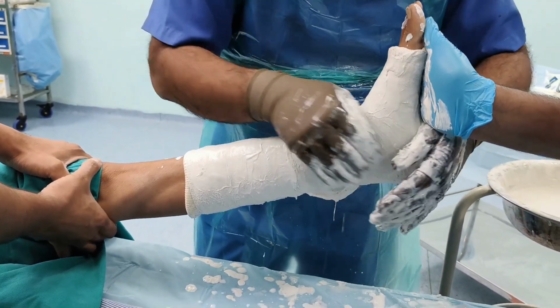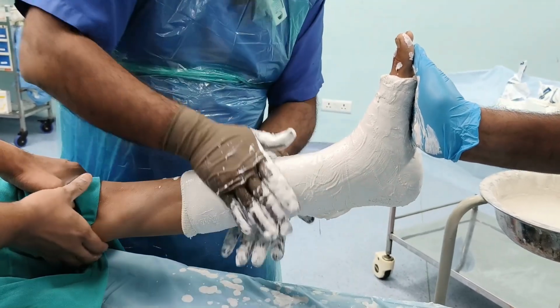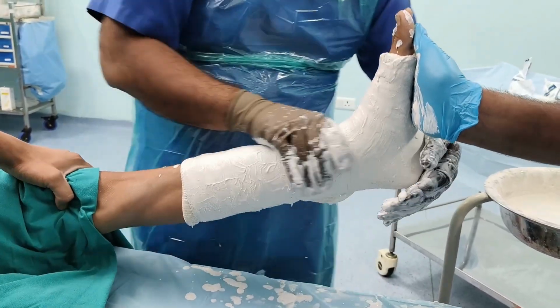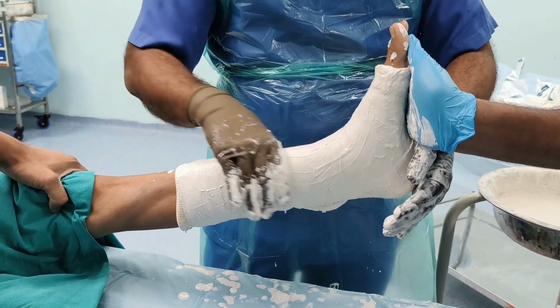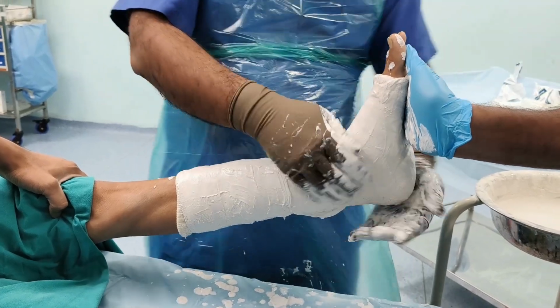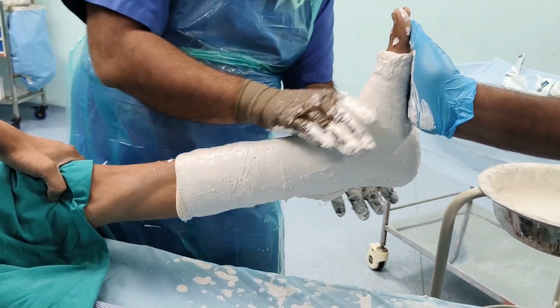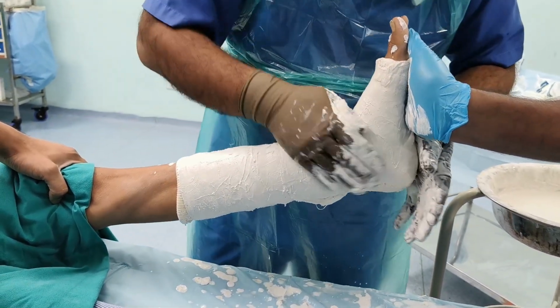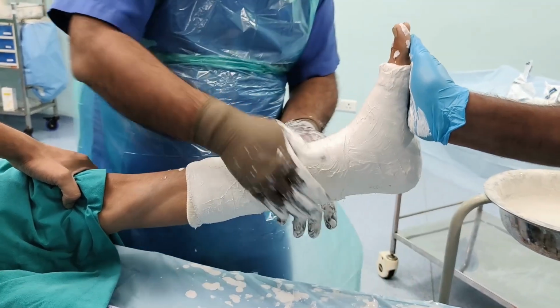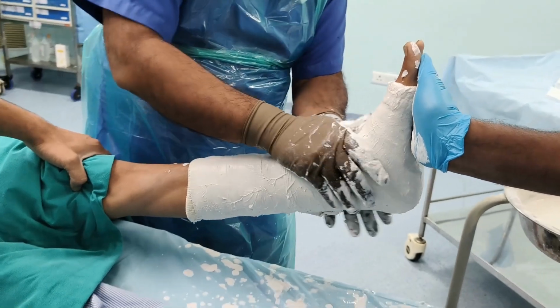The plaster shouldn't be too tight or too narrow, and definitely it shouldn't be loose also. So this is one thing which I cannot just teach you in one video. The adequate tightness of the plaster is one thing which you learn by experience.